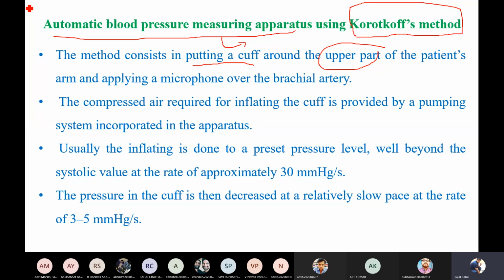And the pressure sensor, the microphone, and the pump will all be connected to a microcontroller. This microcontroller is going to collect the data and give the signal to the pump; everything will be done by this microcontroller.